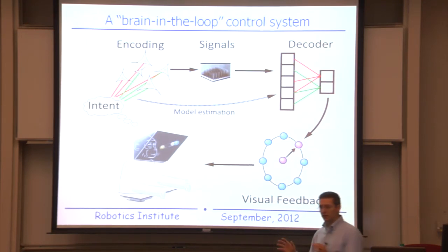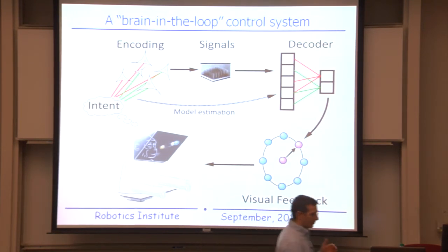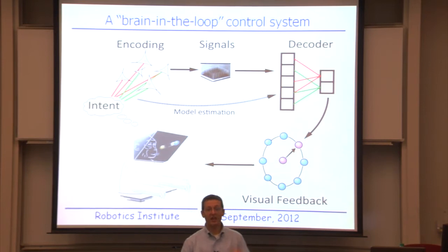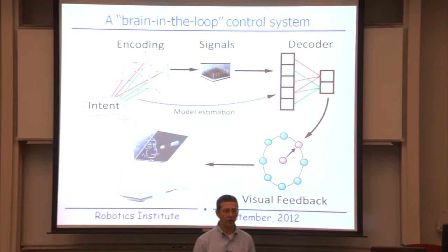So really the only difference between these kinds of devices and the kinds of devices that you in the robotics community are used to working with is the fact that we have actually a live subject in the loop. And this is a blessing and a curse for us. It's a blessing because it means that we can spend a lot less time designing things like intelligent planning algorithms because we have that in the loop already. It's a curse because, unfortunately, we don't really understand how that intelligent planning algorithm is working. And so a lot of times, our decoding approaches aren't actually appropriate for what the subject is doing.